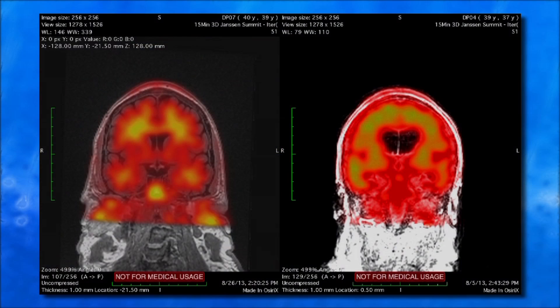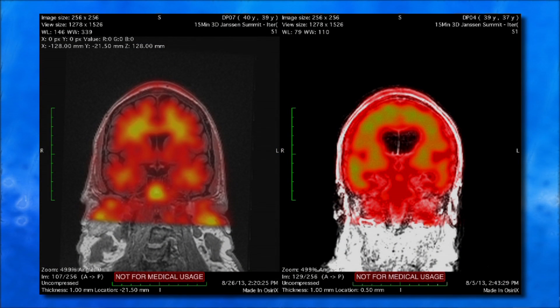What I have here on this computer screen is a set of brain images that's fused between the very high-resolution picture that magnetic resonance imaging gives us and a scan called a PET scan—a positron emission tomography scan. Positron emission tomography allows you to look at a number of different things, because what you can do is inject a slightly radioactive tracer into the body, and it binds proteins that are important in either brain activity or in important proteins, for example, in Alzheimer's disease.